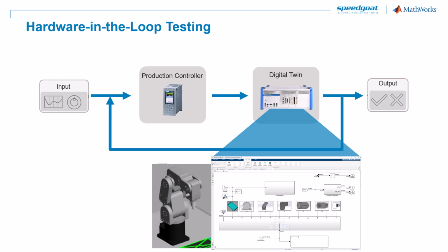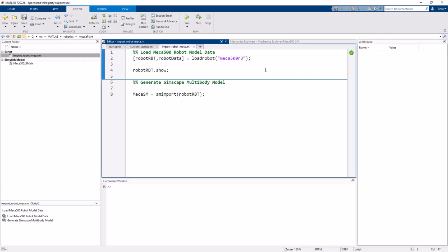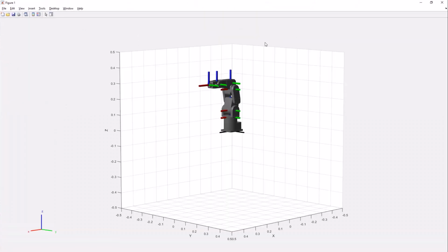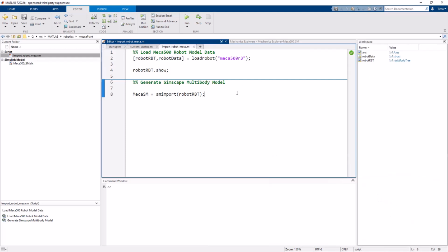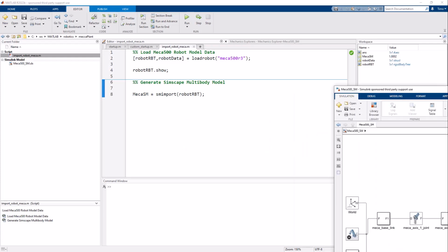When you buy robotic components off the shelf, you typically get the 3D CAD models with it. So I'd like to show you how to use those for creating a Simscape model. For our specific robot arm, the CAD data is already included in the Robotics Systems Toolbox, along with many other 3D models. One simple command loads the data, and we can already view the 3D representation of the robot. Using the function smimport, we can then generate a Simscape Multibody model from it.